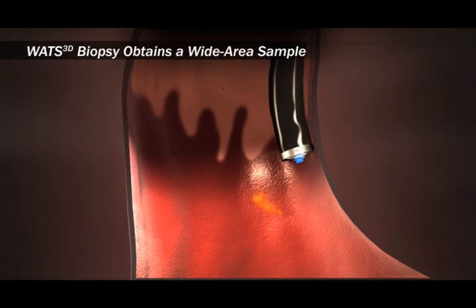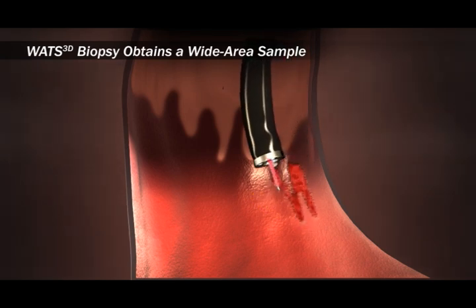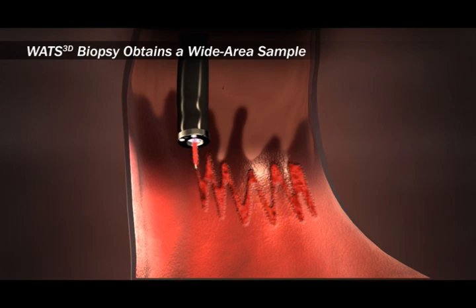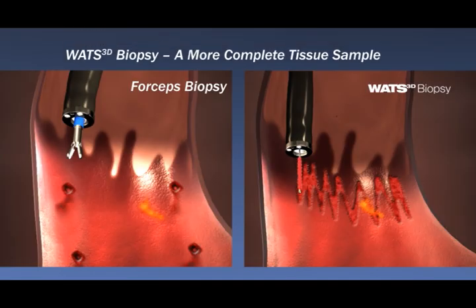The Watts 3D biopsy allows clinicians to collect more tissue over a wider area in the esophagus, making it much more likely that that abnormality will be sampled.